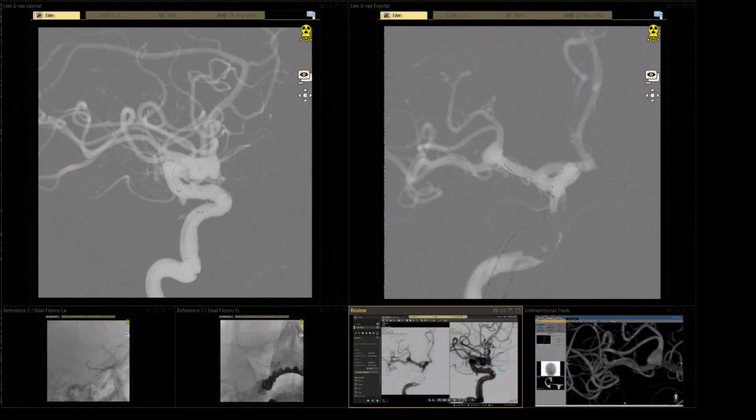It's like this. First of all, we will go with the Headway 17, and we need to go to the lower branch. This usually should be no problem.